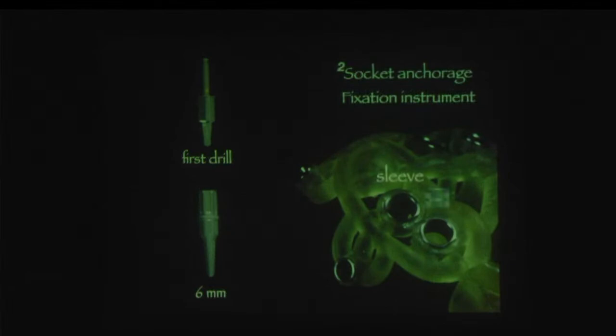the second fixation instrument, when we make the first drill, when we make the first osteotomy, it's around 6 millimeters in depth. And after making the osteotomy, we can use a screw which we call socket anchorage fixation instrument. In the osteotomy socket, you place it and turn the screw, because sometimes we need more fixation in the bone, especially in the edentulous sides, not with the tooth. We use this alternative method to fixate the guide.